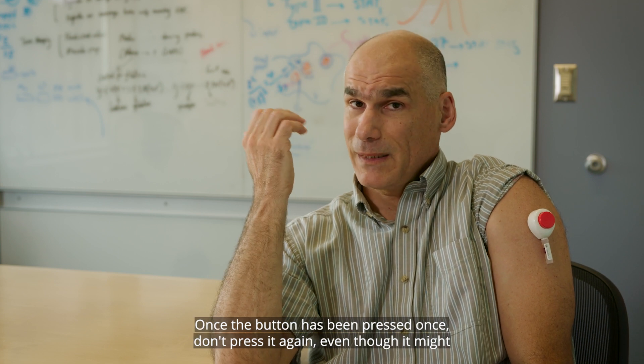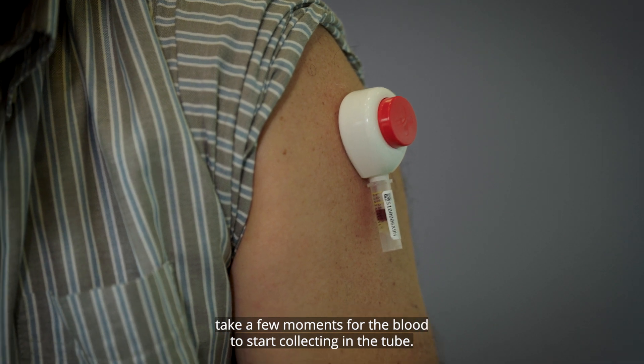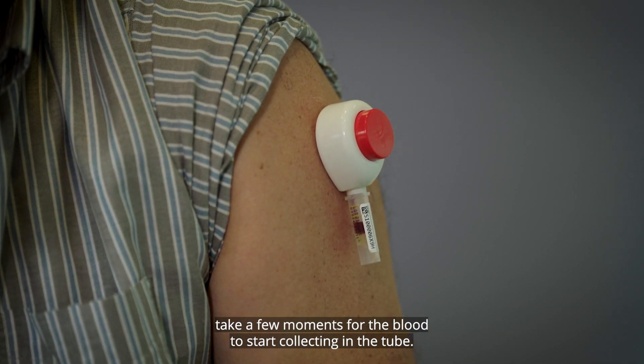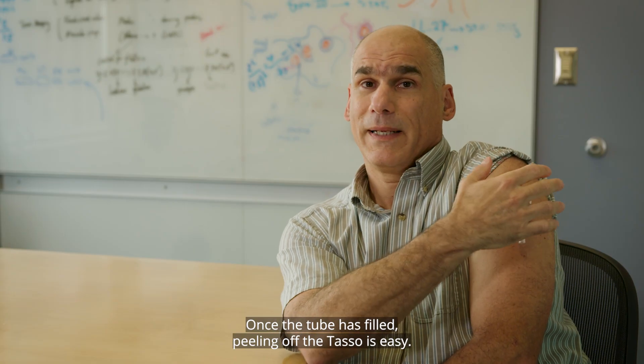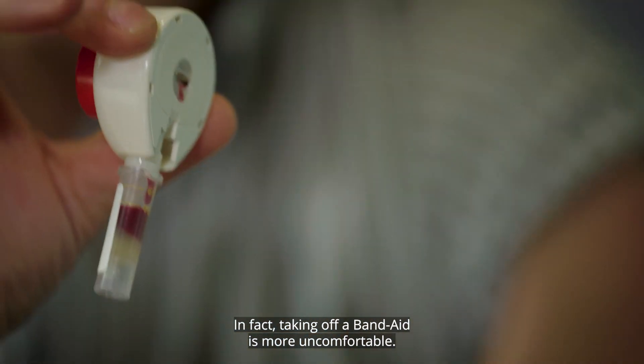Once the button has been pressed once, don't press it again, even though it might take a few moments for the blood to start collecting in the tube. Once the tube has filled, peeling off the TASO is easy. In fact, taking off a band-aid is more uncomfortable.